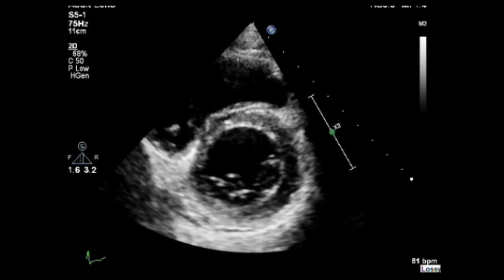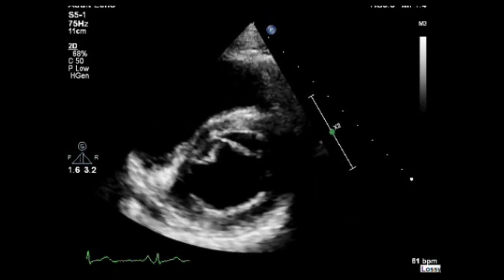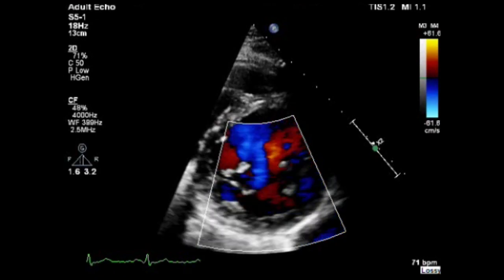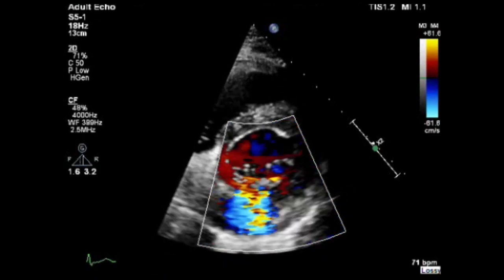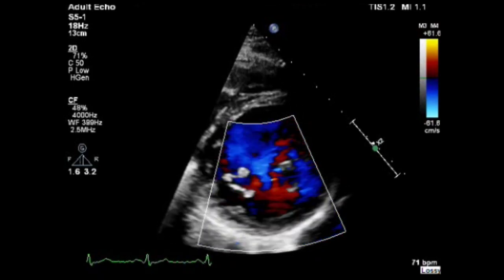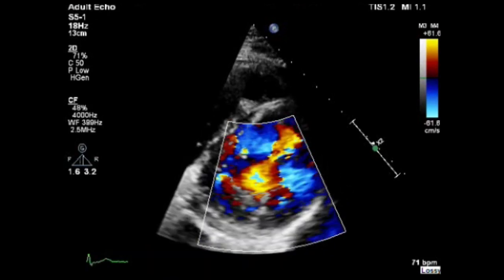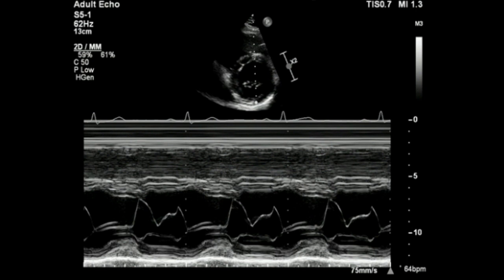Next is the short axis view at the mitral valve level. Assess the anatomy of the mitral valve, also the right ventricle and the pericardium. Now use color Doppler and place it over the mitral valve to assess for and identify the origin of mitral valve regurgitation. When you finish the color flow assessment, place the cursor across the mitral valve and obtain an M-mode of the mitral valve.